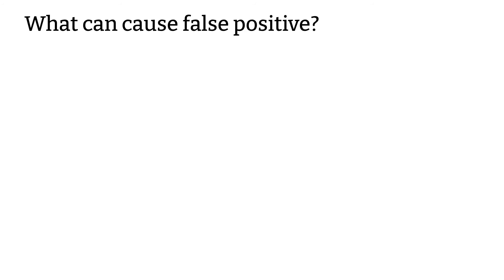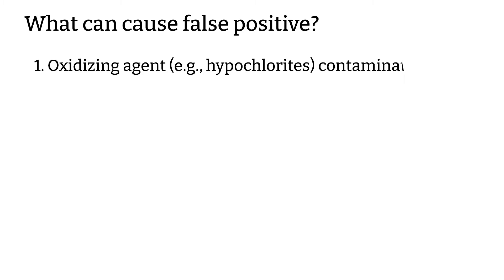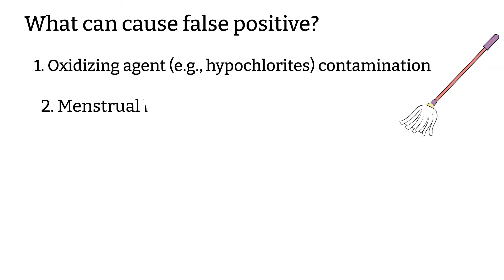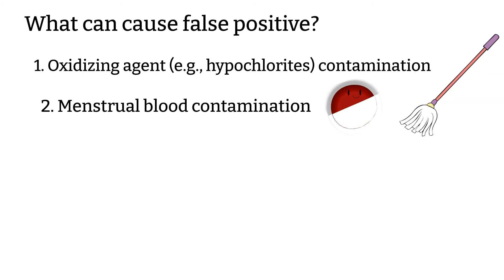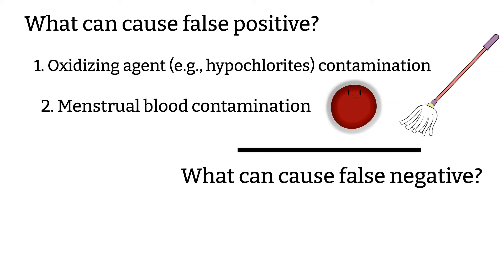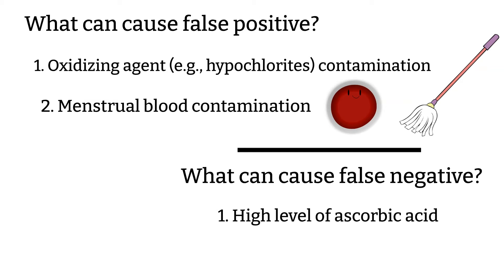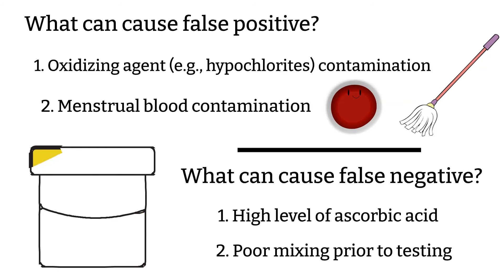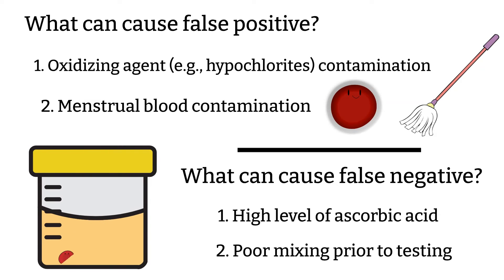Now let's talk about false positive and false negative results. For false positive, contamination with oxidizing reagents like hypochlorite and menstrual blood can cause false positive test results. As for the false negative test results, a high level of ascorbic acid can give a false negative result, as well as not mixing the sample thoroughly before the test — this can also give a false negative because RBCs are heavy and could settle to the bottom of the specimen cup.